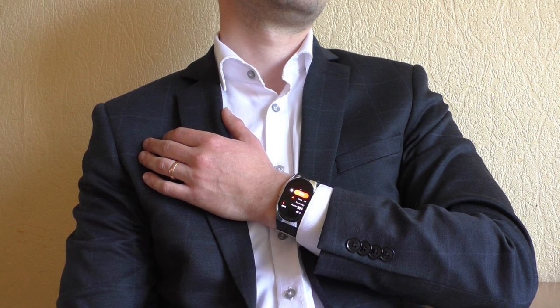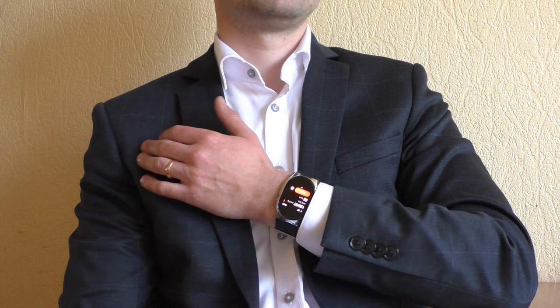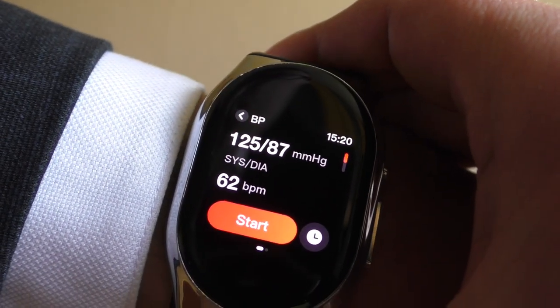It's almost done — just a little more patience. And it is real time, not sped up — it doesn't take that long. Surprisingly, one measurement like this takes about 1.5% of the battery, which is surprisingly efficient. And here are my results.